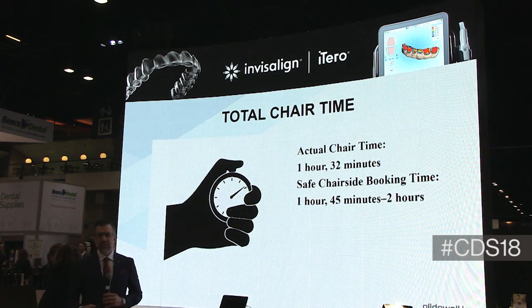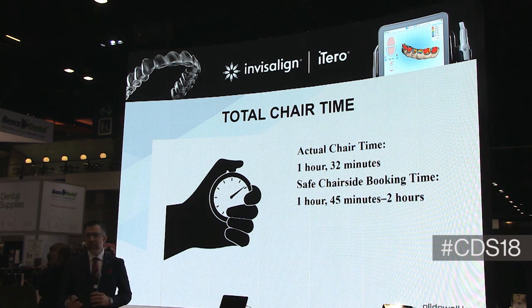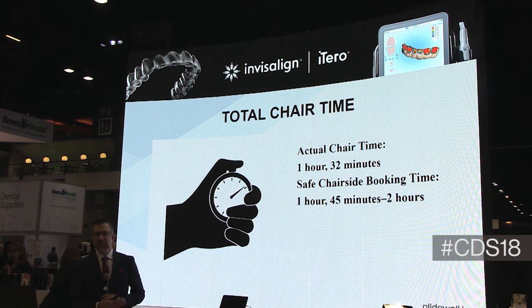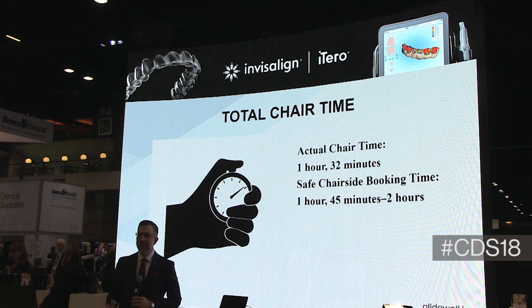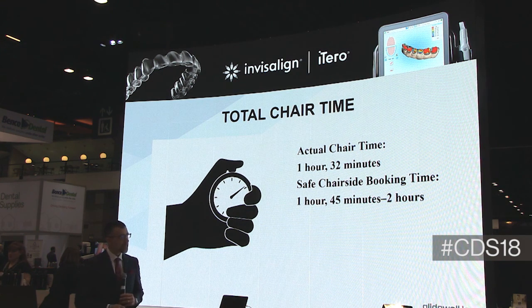So on these cases, remember the milling time is going to take about 35 minutes, sometimes 40 minutes. But also remember your other choice in a situation like this is lithium silicate. It's going to take as long to mill that restoration and then fire that restoration. So don't let the milling time be a deterrent for you.